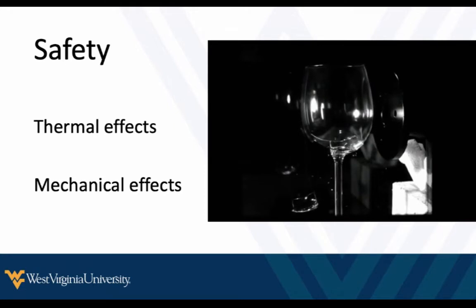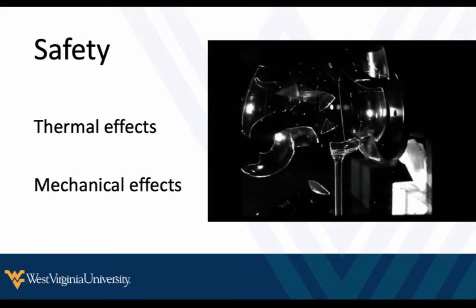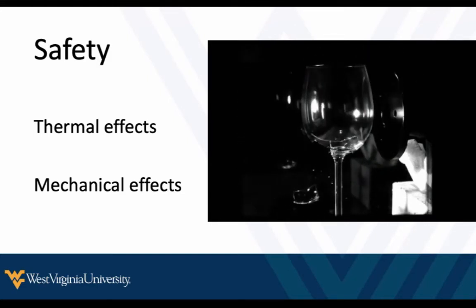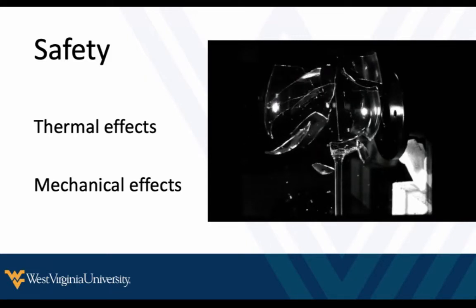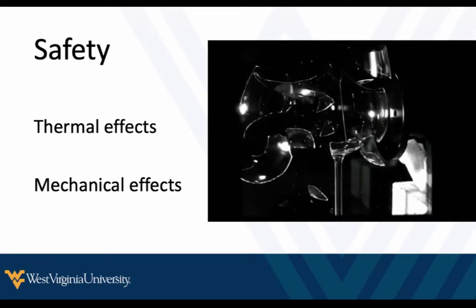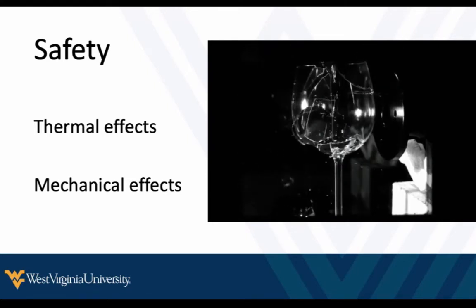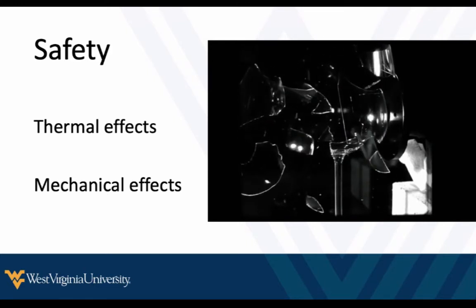A little bit about safety. The nice thing about ultrasound is it's super safe, so there's not a lot to worry about here. There are theoretical things that you can think about, but none of these are really an issue with diagnostic ultrasound and the energy levels that we're using to image patients. But sound, as you know, can destroy tissue. There are thermal effects, so it can heat the tissue, and mechanical effects where you can form bubbles that burst in the tissues. Again, that doesn't really happen in the diagnostic range, but they're important things to know about and just concepts.